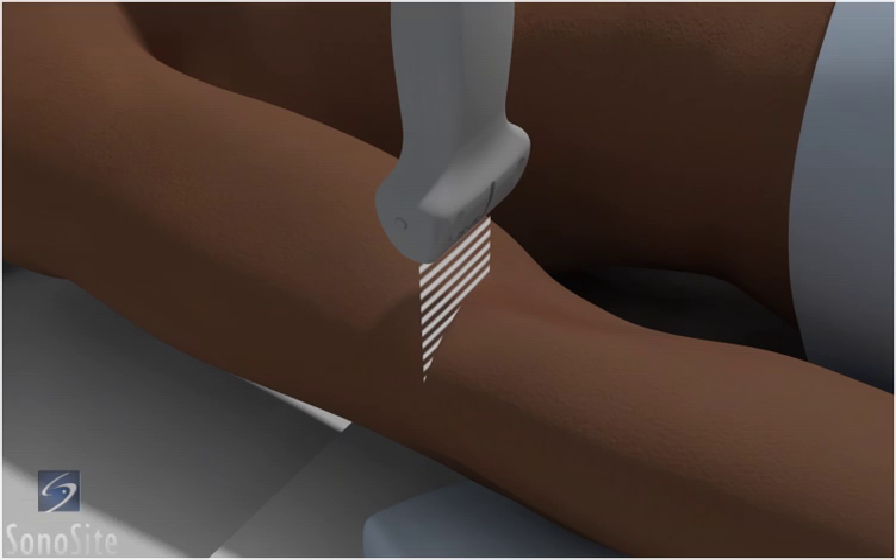The patient is placed in a supine position with the elbow extended over the examination table, a pillow under the elbow, and the forearm supinated.